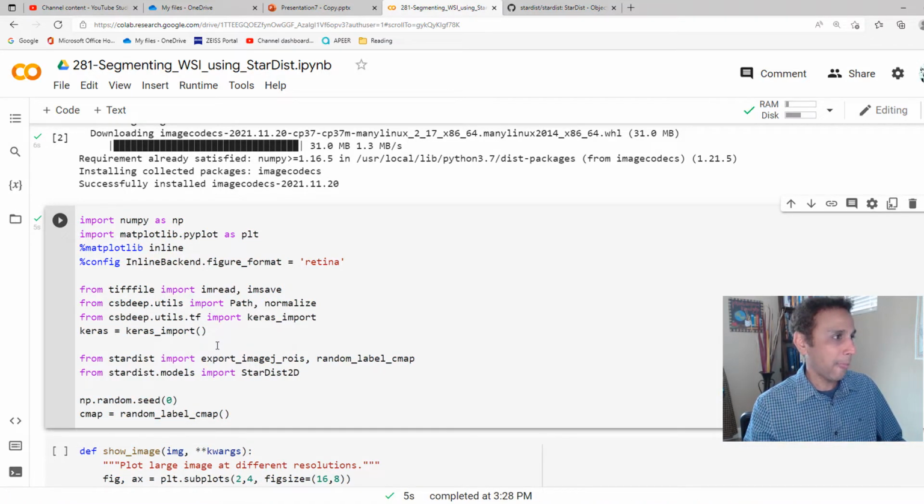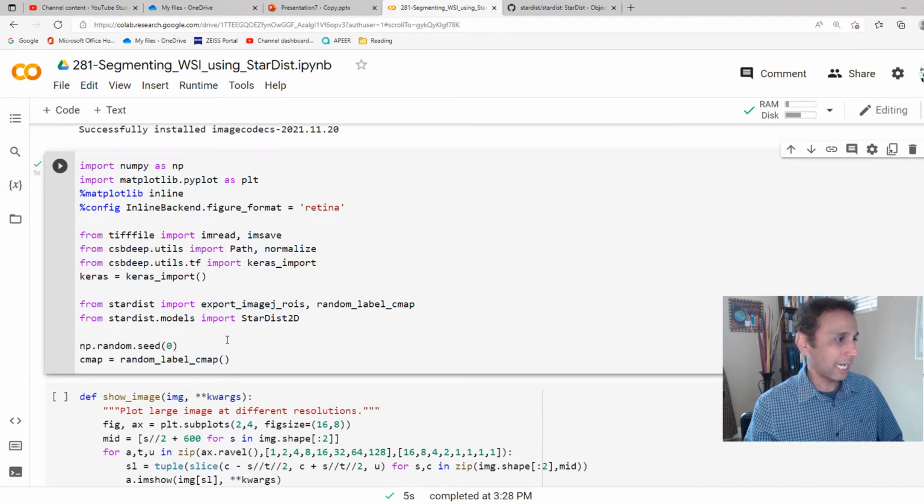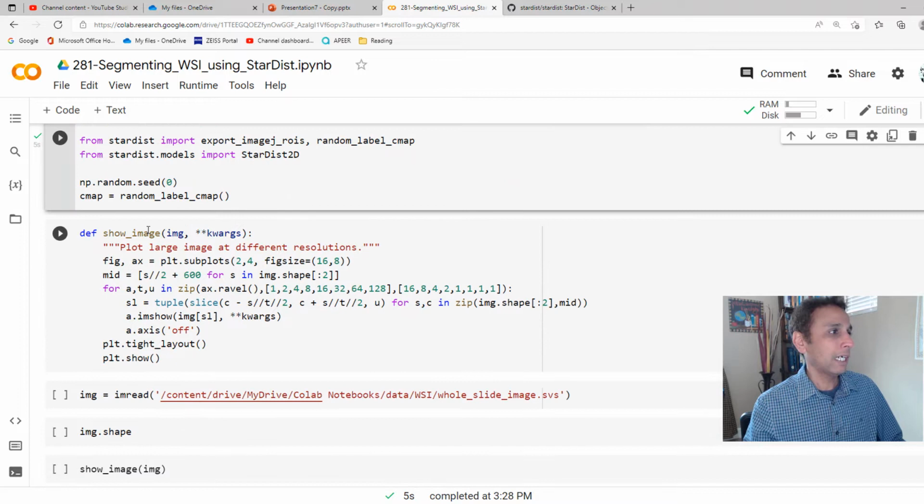Nothing pretty deep. There's nothing that requires extra explanation that I haven't covered in the last couple of videos. So these are the standard libraries. And now let's go ahead again.